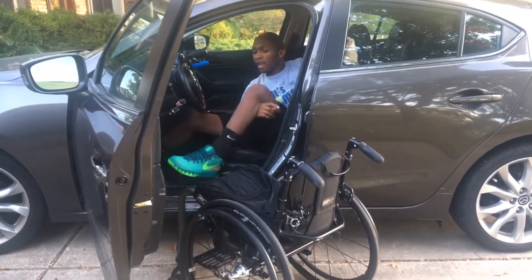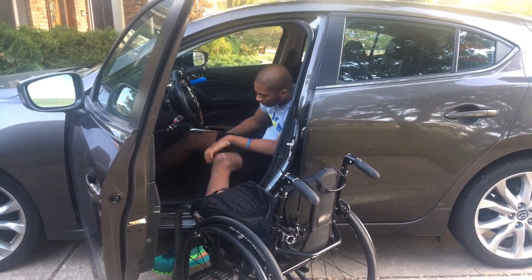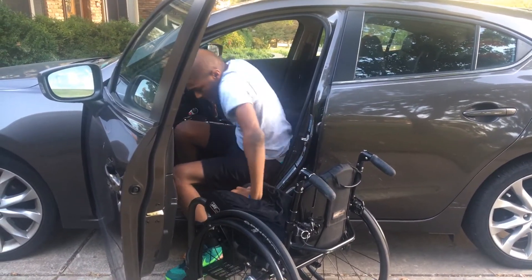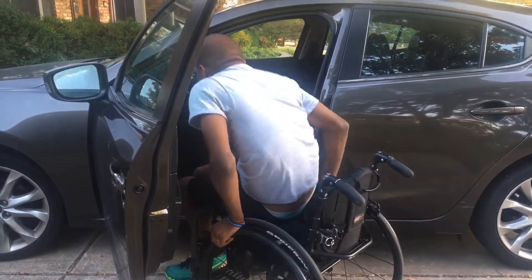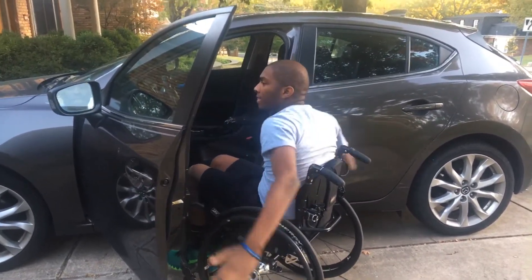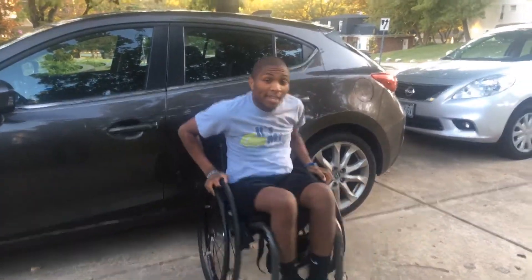Then how I get out is I put my left leg out — same thing but in reverse — and do your standard transfer. This also took me a while. And that is how you put your chair in and out of your car.